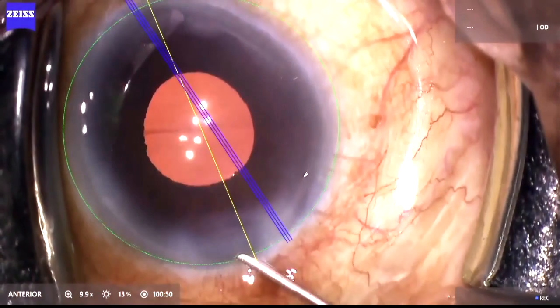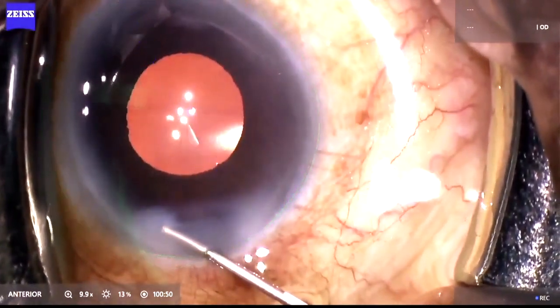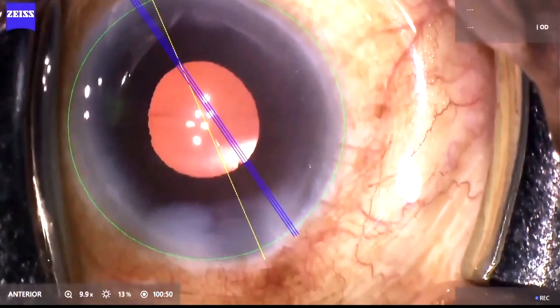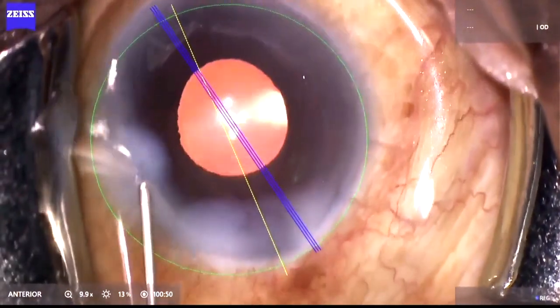The mark usually stays on the IUL for approximately five to six minutes, after which it starts to fade — which is a good enough time for an experienced surgeon to aspirate the OVD and position the toric IUL in its desired axis.